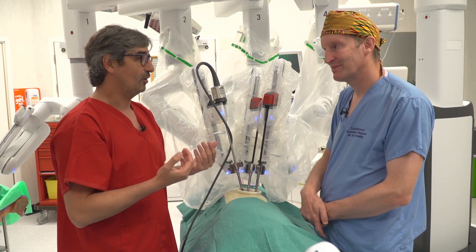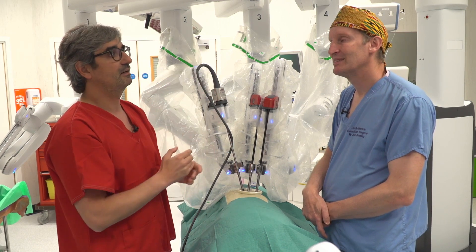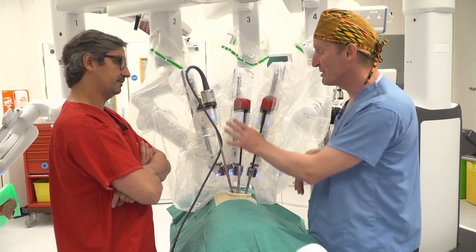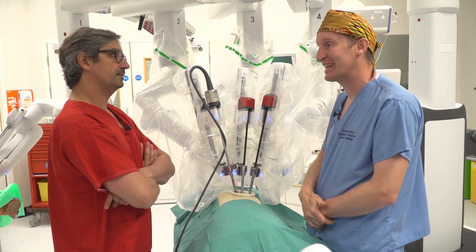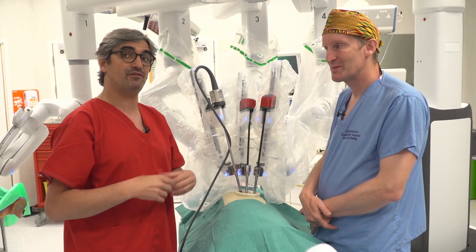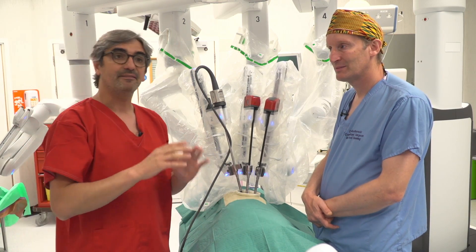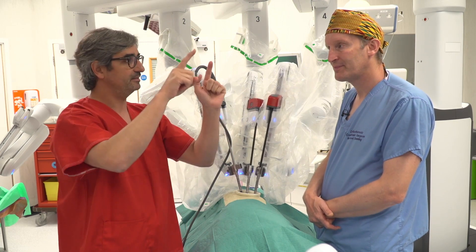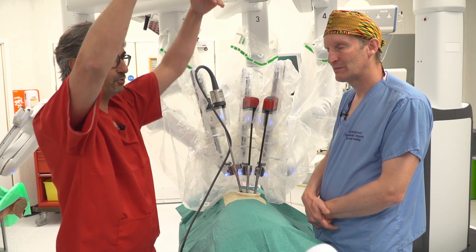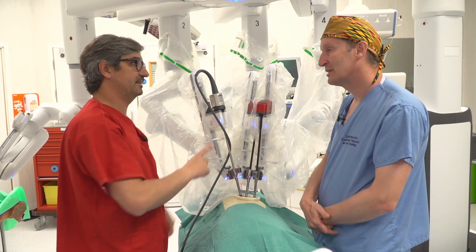Of course, if you are doing uniportal VATS at the seventh intercostal space it would be extremely difficult to do an upper lobe — too high for VATS, but not for the robot. We're just using a zero camera for this demo to save our 30-degree scope for the case this afternoon. But it's 30-degrees down, and that's key to not having any clashing at all. We always keep the 30 down, like in uniportal VATS. However, there are tricks — in cases of adhesions where you need to reach the apex or anterior/posterior parts, you can switch and put the 30 up, then you can release the adhesions easily, completely changing the movements.